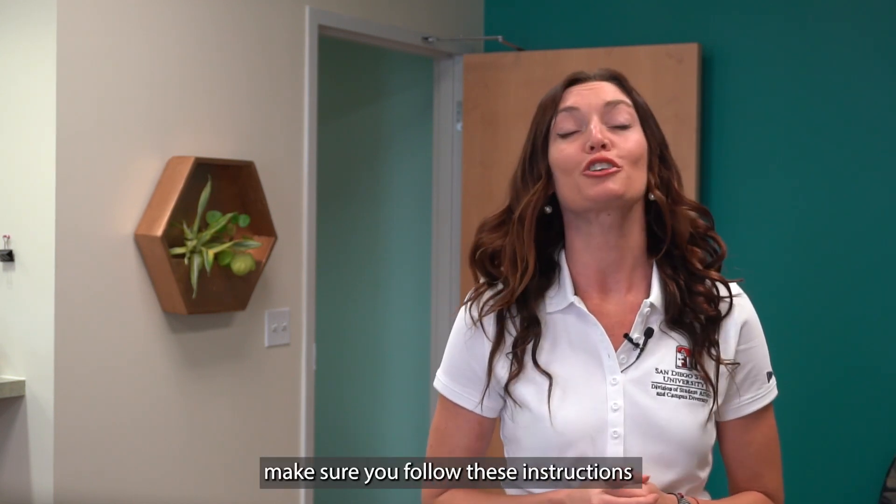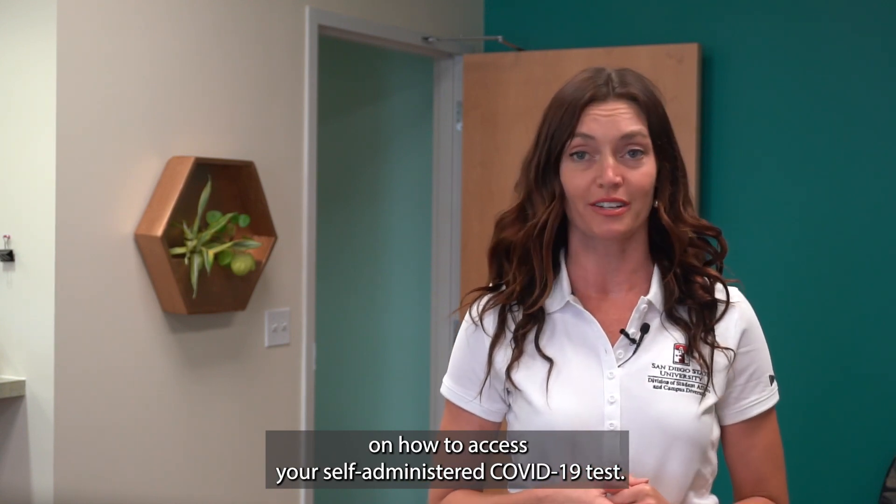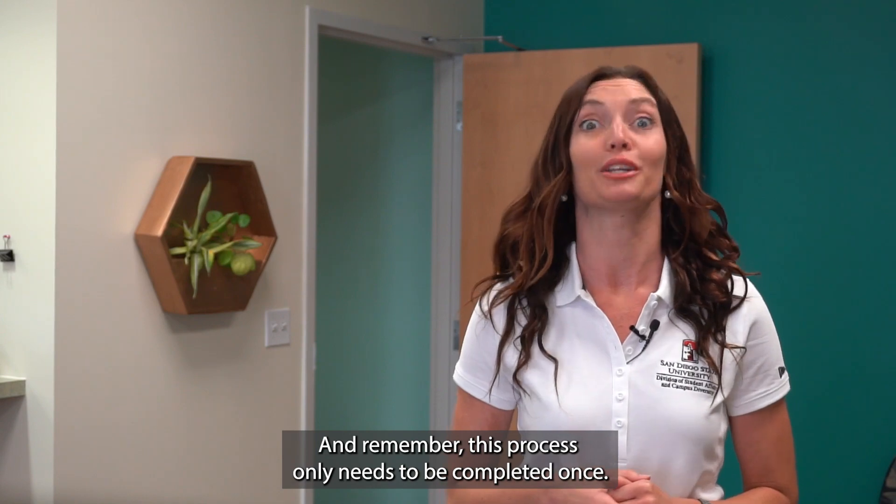For first-time users, make sure you follow these instructions on how to access your self-administered COVID-19 test. Remember, this process only needs to be completed once.